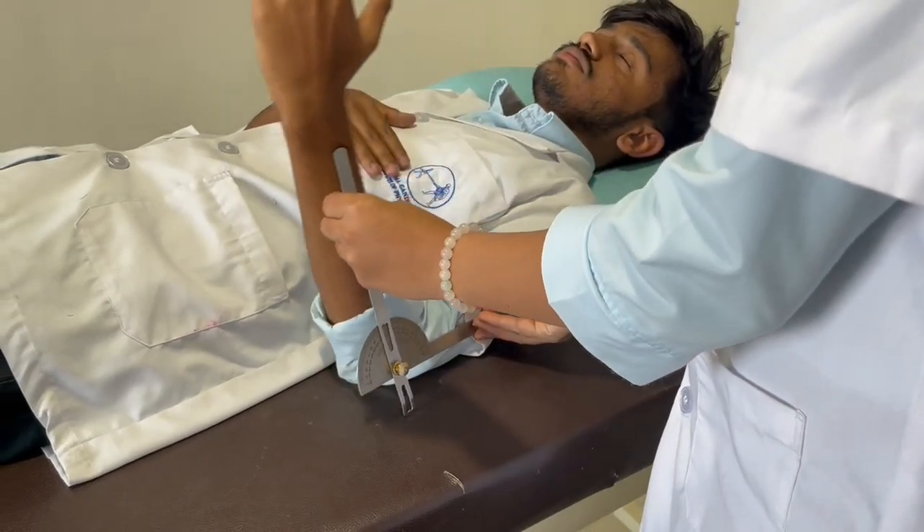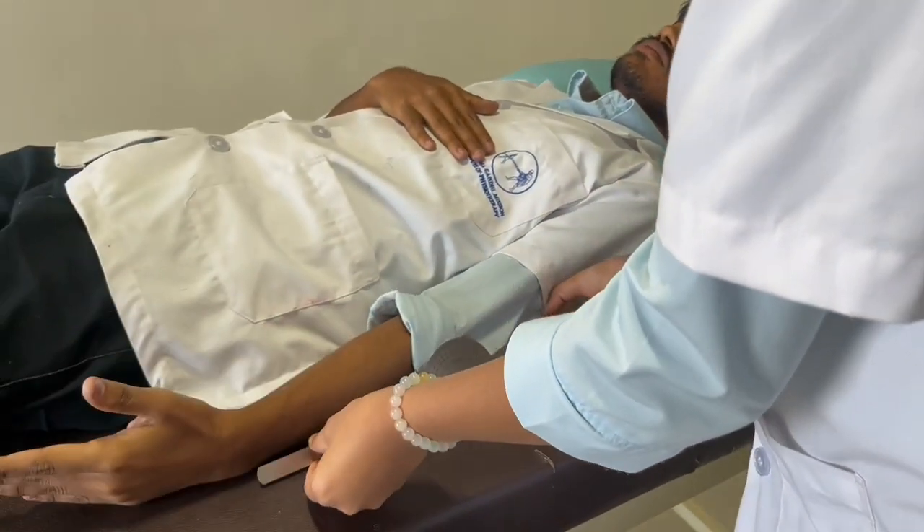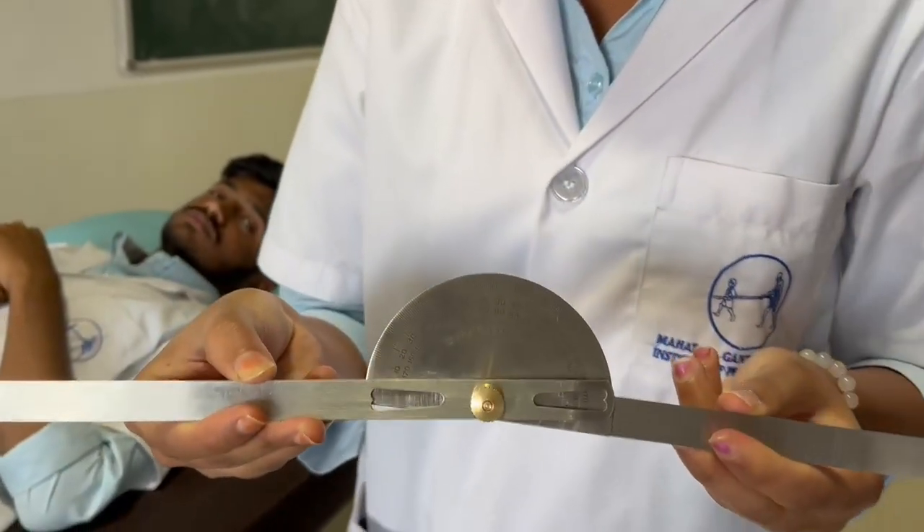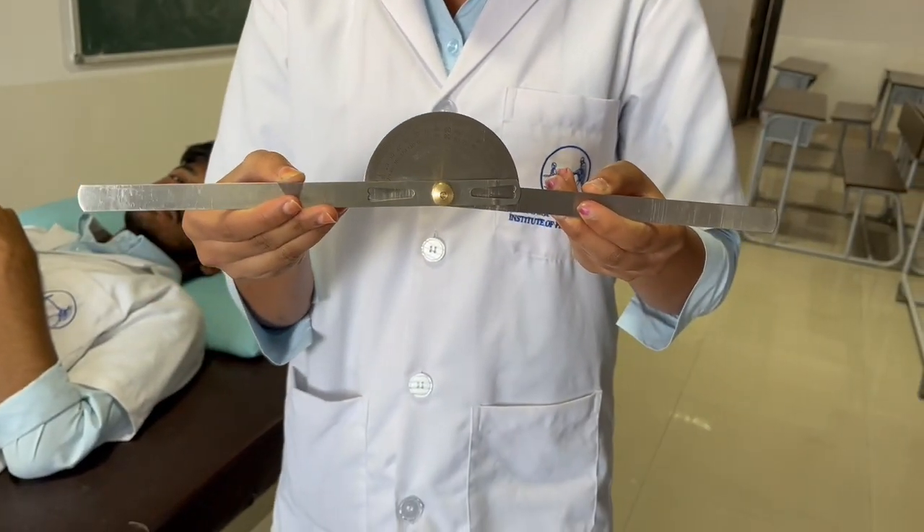Next, we'll be seeing elbow extension. The stabilization and goniometer alignment is the same as for elbow flexion. The normal range of motion is from full flexion back to zero degrees of extension.